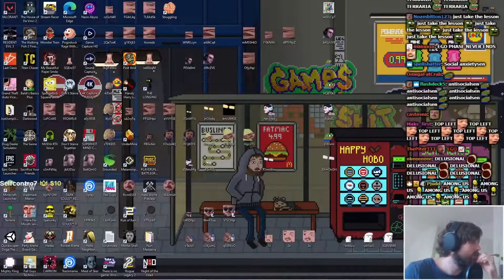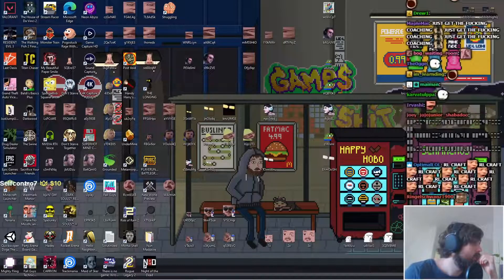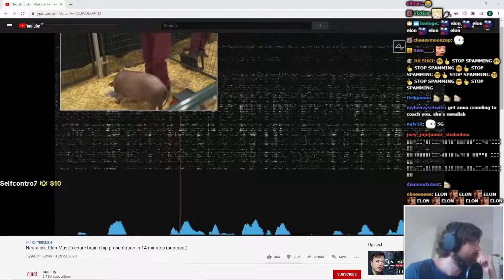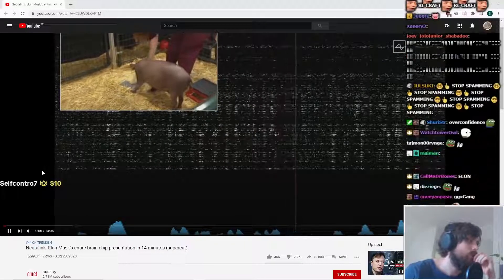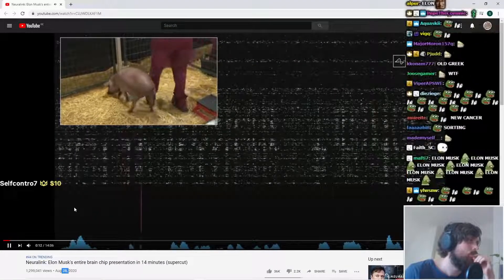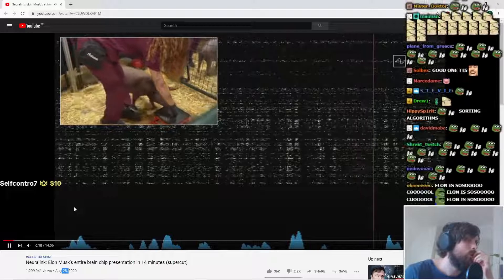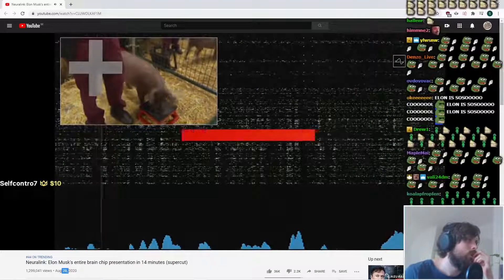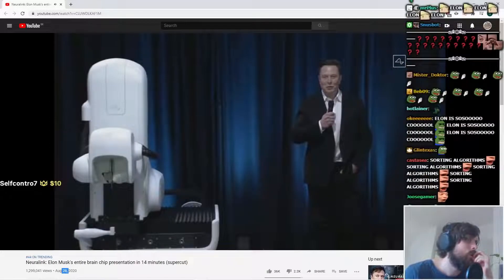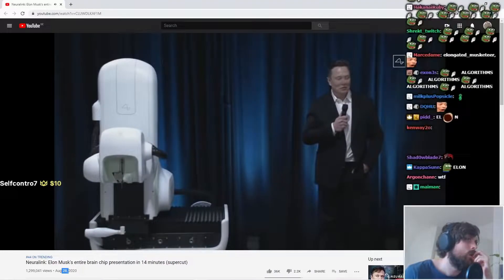Neuralink — Elon Musk's entire brain chip presentation in 14 minutes. I see this is interesting. I haven't talked about this before, but this is new. Welcome to the Neuralink product demo. I'm really excited to show you what we've got. I think it's going to blow your mind.